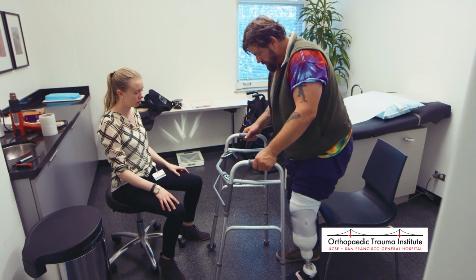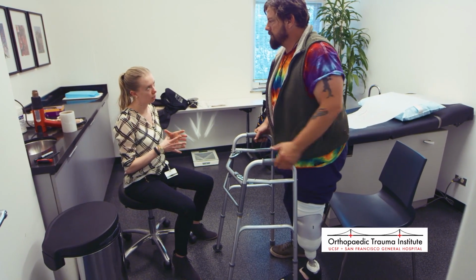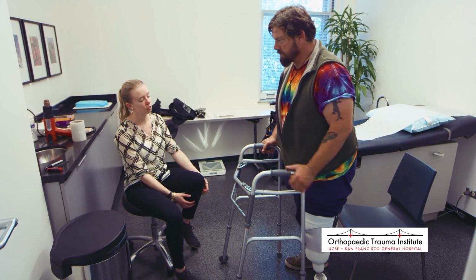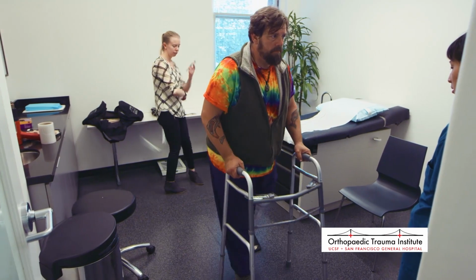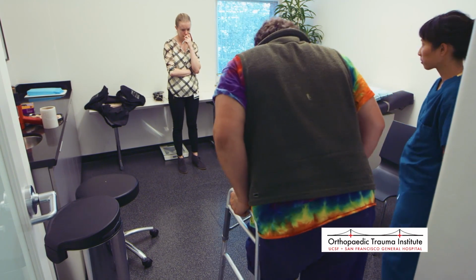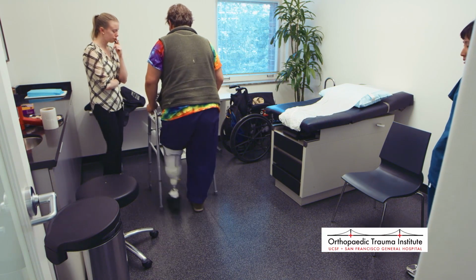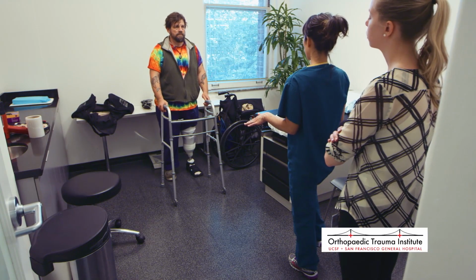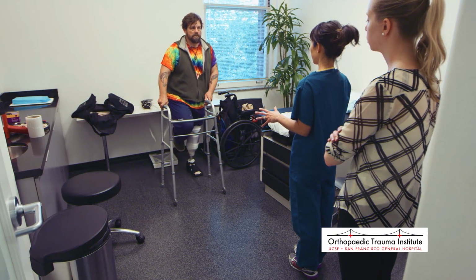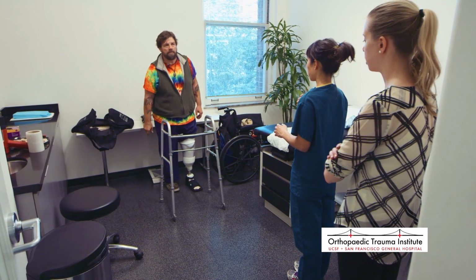And then he stood up with the walker. I performed the static alignment, so I looked at his height and his initial alignment in a standing position, confirmed his safety and made sure he was comfortable, and then started walking training with steps, starting with a single step and then doing step-to gait, and then progressing to step over step with the help of Michelle, physical therapist. We tag teamed and worked off each other to start teaching him more about even weight shifting and using his whole body and trunk to really stabilize himself when he was walking.